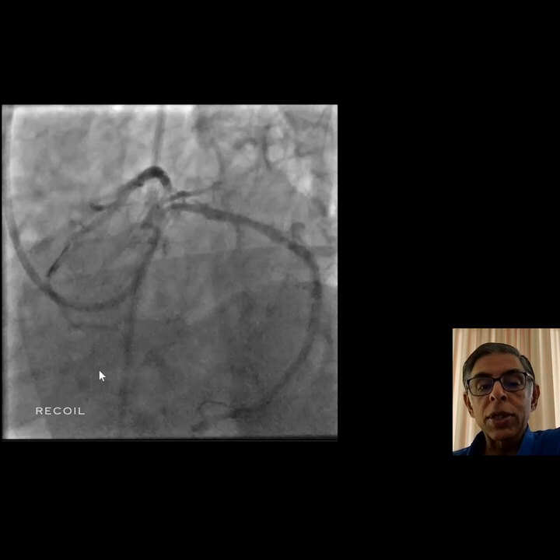So then the question is, how do you stent this anatomy where you have two severe lesions at the ostial LAD and ostial circumflex, and the left main is pretty clean, and the left main is also quite short. And of course, there are multiple two-stent techniques, which include DK crush, culotte. And in this particular case, we opted for V stenting because the left main was very disease-free.